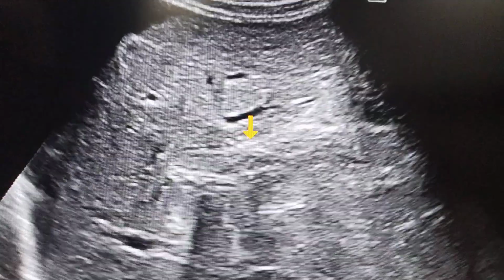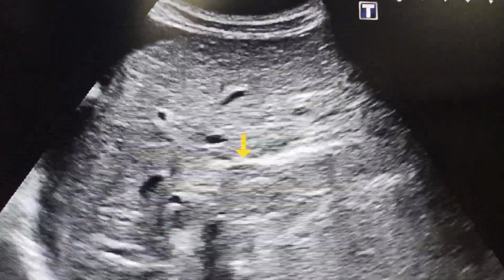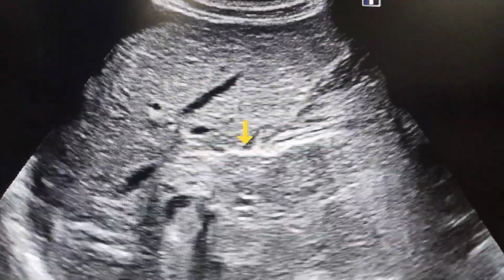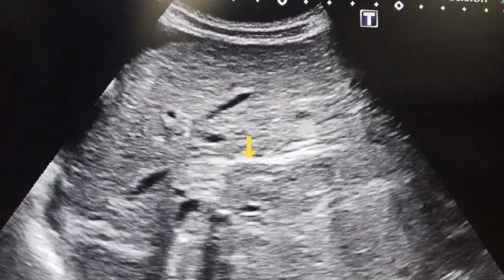Always use the linear probe while assessing liver cirrhosis: its coarseness, its nodularity, its surface margin.